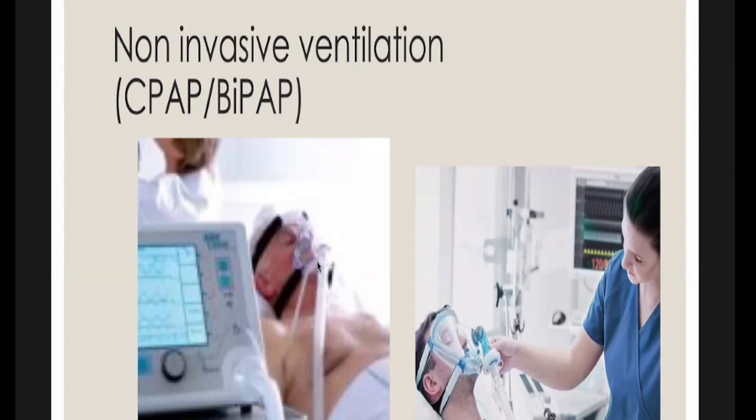Any of these masks should be tight fitting. It should be according to the patient's shape, and it should be nicely sealed around, and there should be no air leaks. Then a patient should be advised on the feeling that they are going to have. It's sort of a gush of wind coming onto your face, and it is a little difficult because they have to breathe while this amount of air is coming into their airway passage.